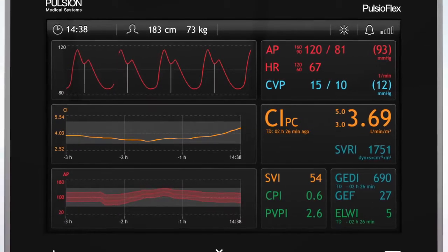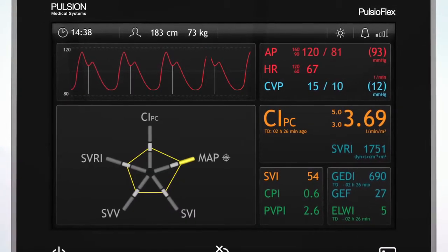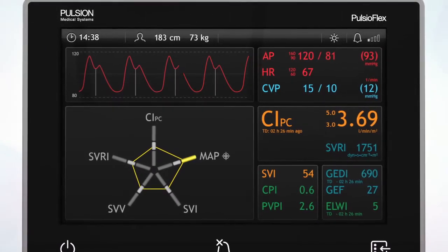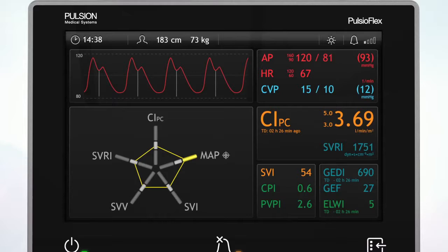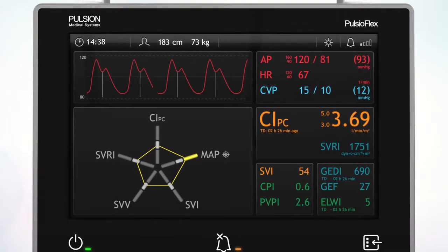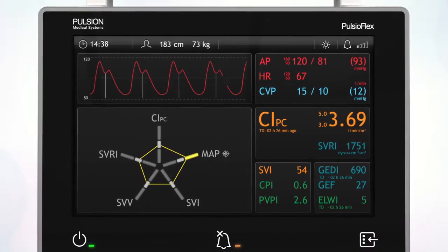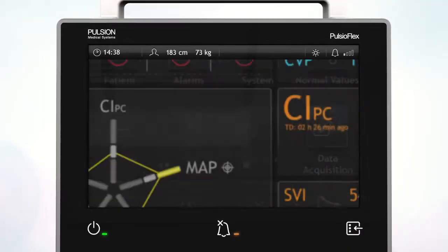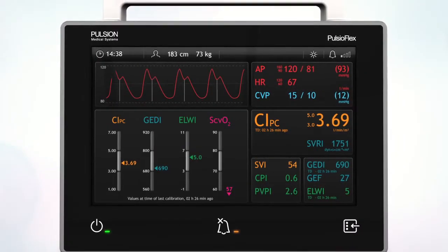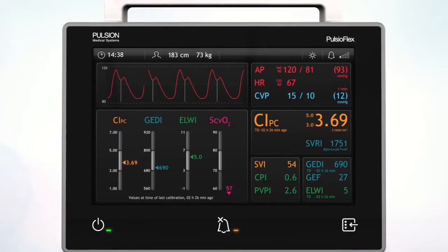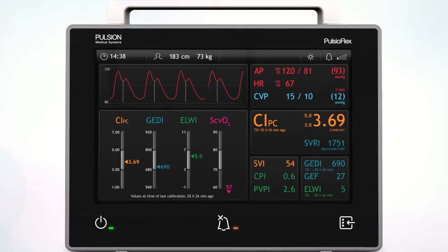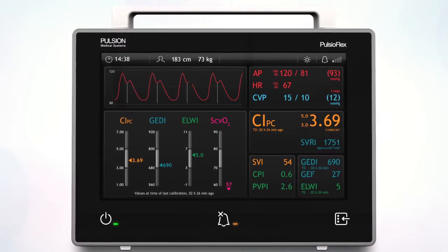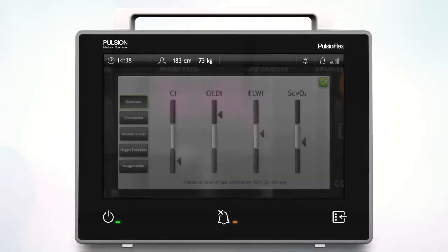Further screen layouts include the SPDR and the Profiles diagram. The SPDR vision screen allows you to check the general hemodynamic situation at a glance, even from a distance. Parameters and numbers can be configured by tapping on the diagram. The Profiles screen gives you detailed insight into the specific parameters, their interactions, and deviations from normal ranges. It can be adjusted accordingly by tapping on the diagram.